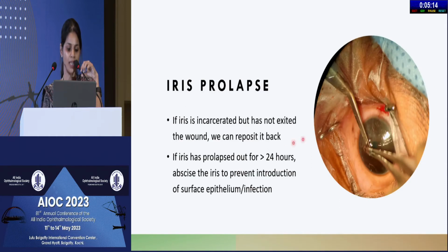If you have iris at the wound but it has not exited the wound, we can just gently reposit it back. But if the iris has prolapsed out for more than 24 hours, it's preferable to abscise the iris to prevent introduction of surface epithelium or infection.